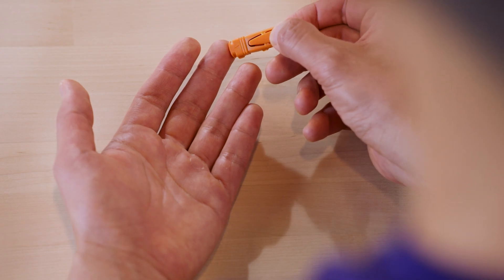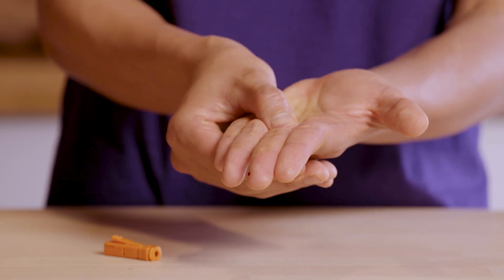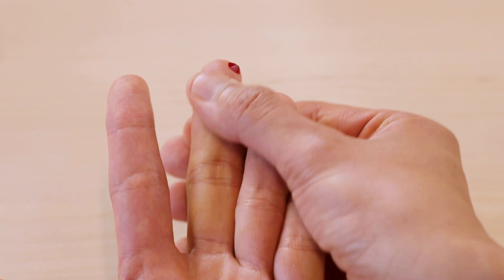When you're ready, press the release tab firmly. The lancet will make a quick, gentle prick and the needle will retract automatically for your safety. Massage the hand three times from the base of the palm to the area of the puncture. Keep massaging the hand until a large, full drop of blood appears.